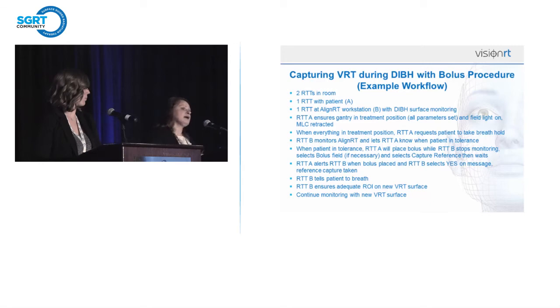What's really important, not on this list, but very important, is to actually talk to the patient before you do this procedure so that they know they're supposed to hold their breath the whole time, even if the red light goes out, even if they hear the therapists saying okay to each other. So something that I like to always say to the patient is just hold your breath until I tell you to relax. And then it's also important to tell them that if they, for some reason, need to breathe before we get that final capture, to just let the therapist know that they weren't holding their breath.